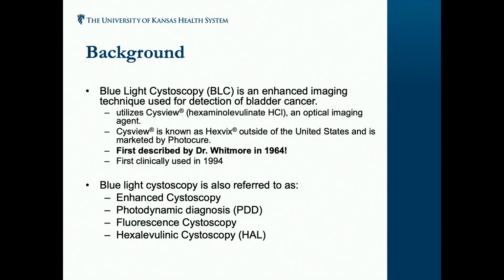So just a little bit of background. You may know it's an enhanced imaging technique. It uses what's called Cysview, that's the product. HAL is what I'm going to call it because it's really hard to say that word and I always mess it up. Interestingly enough, it was first described by Dr. Whitmore back in 1964. So this thought about how we do this has been around for a really long time.